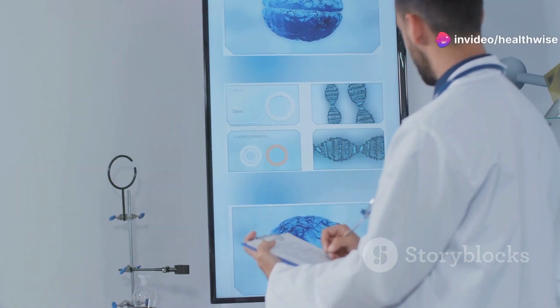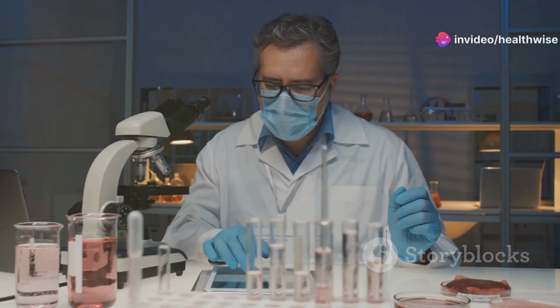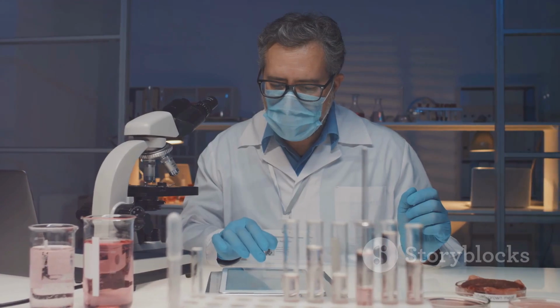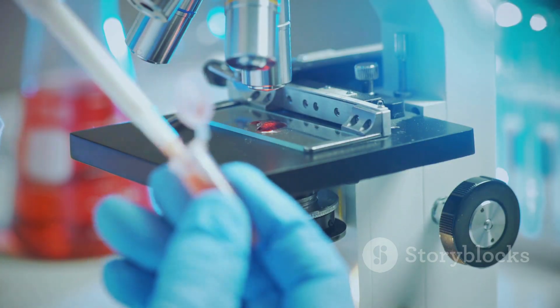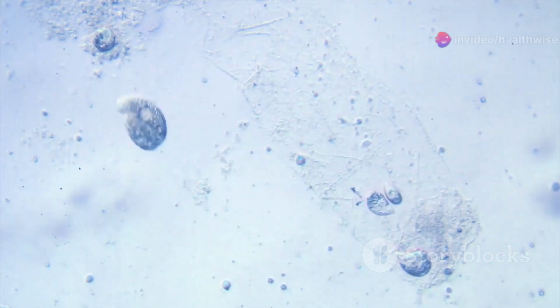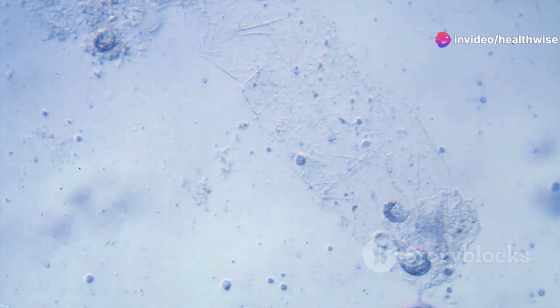So how do you actually count these cells? If the CSF is clear, you can use a Neubauer counting chamber with well-mixed, uncentrifuged, undiluted fluid. You'll count the cells in all 9 WBC squares. The number of cells you count is approximately the number of cells per cubic millimeter of CSF.